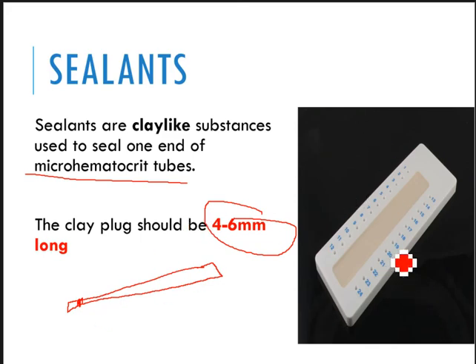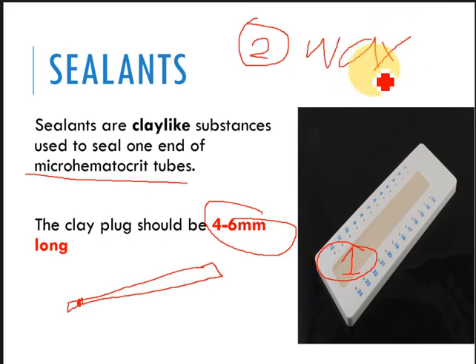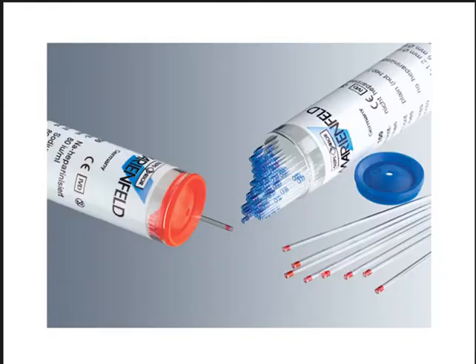Okay. Now what we use in medtech is we have this clay and we also incorporate wax. Okay, candles, for dual purpose. Now next, this one, guys. So we usually seal the end without the band, with the band going into the blood. This is where you usually collect the blood. And then without the band, here you seal.